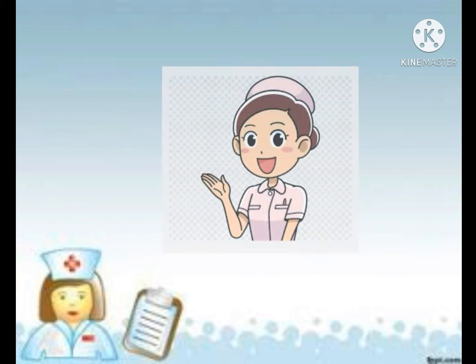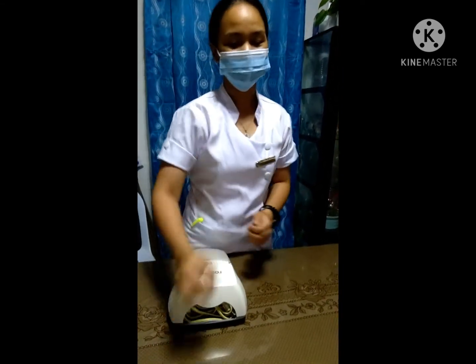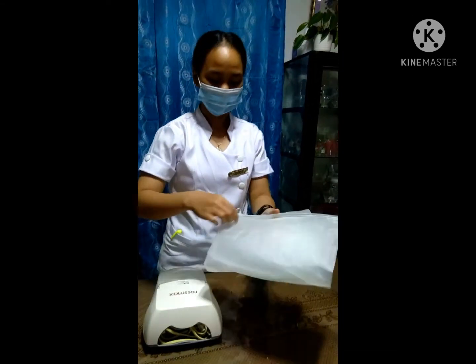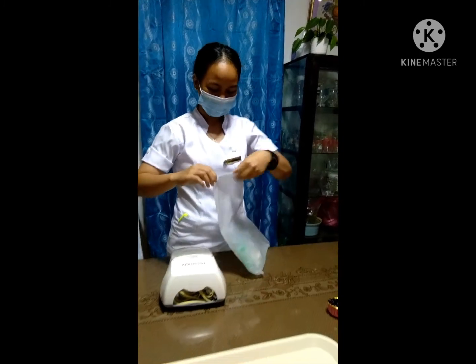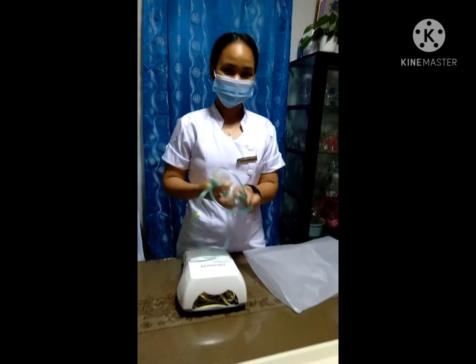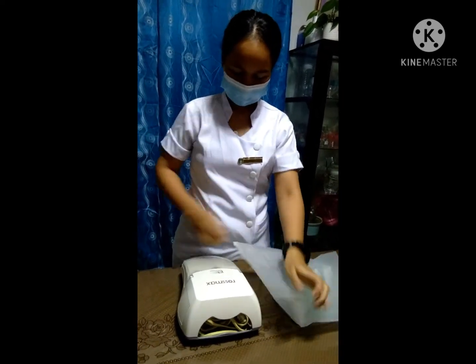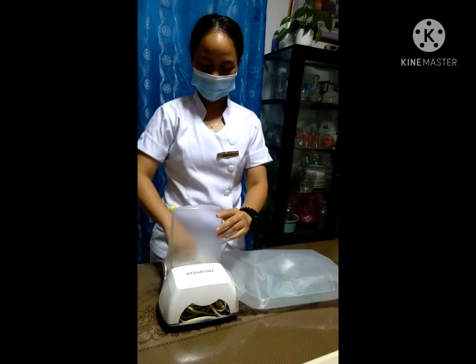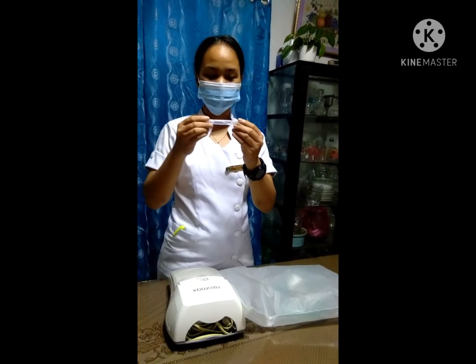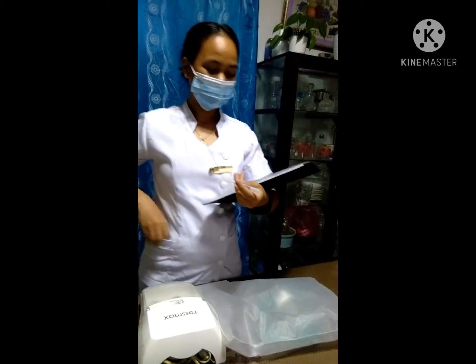The following is the procedure of the nebulization and its rationale. Gather equipment. Check medication order against the original physician's order according to agency policy. Clarify any inconsistencies and check the patient's chart for allergies. This comparison helps to identify errors that may have occurred when orders were transcribed. The physician's order is the legal record of medication orders for each agency.